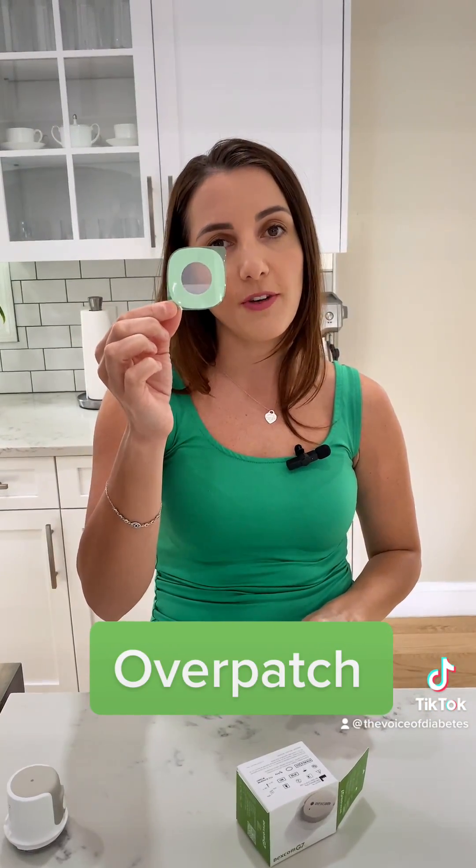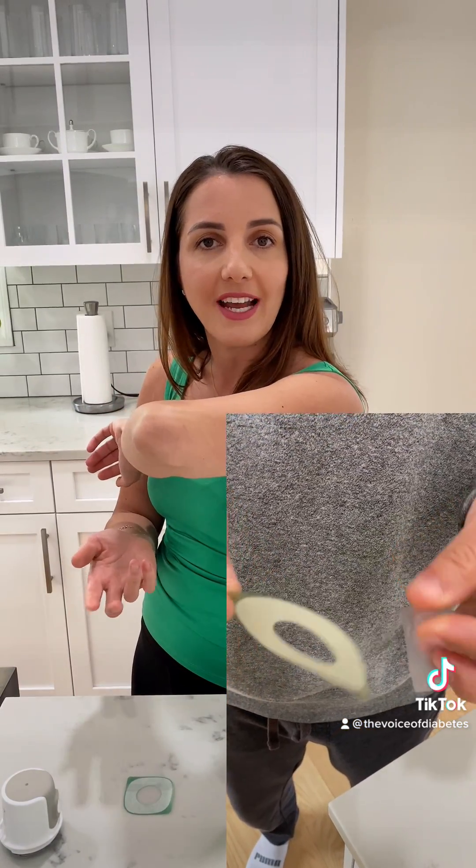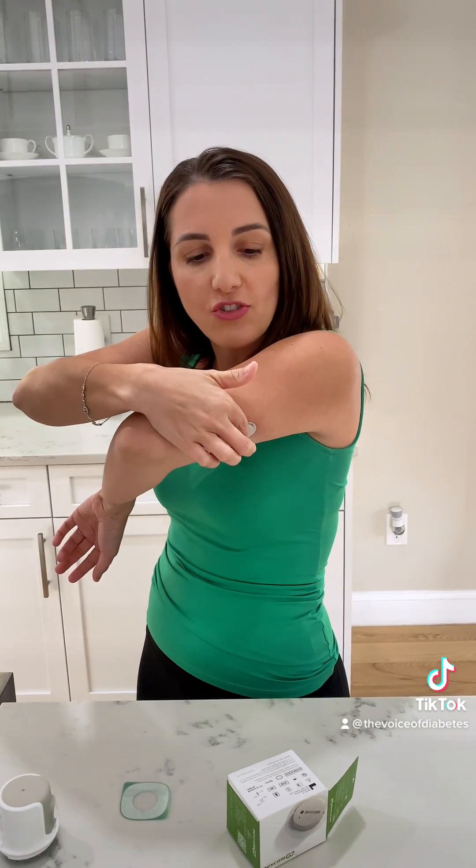You can use a mirror for the overpatch, but in this case I'm going to have my husband put it on because I don't have a mirror. It really just protects it and keeps the sensor more secure for the next 10 days. I like to rub around it about three times to secure the adhesive, then press on the center very lightly for about 10 seconds to make sure it's nice and secure.